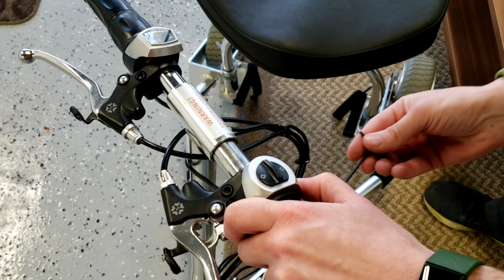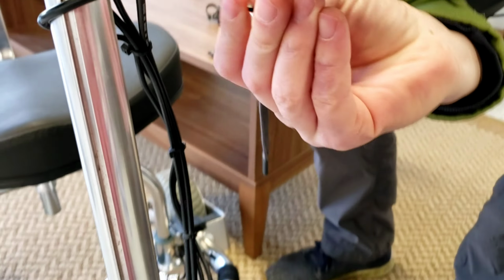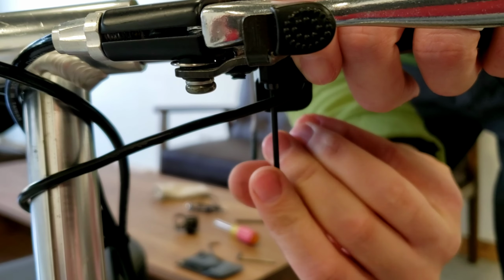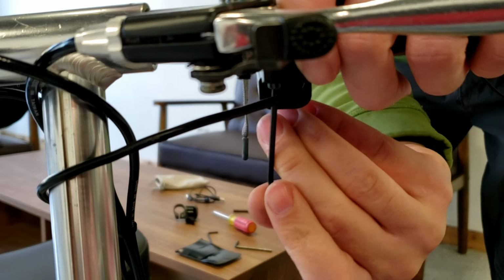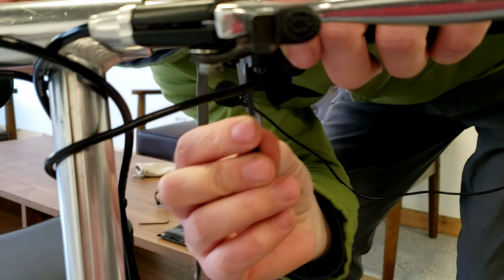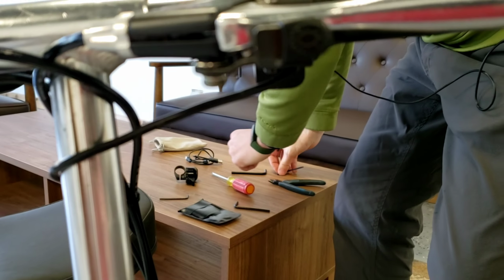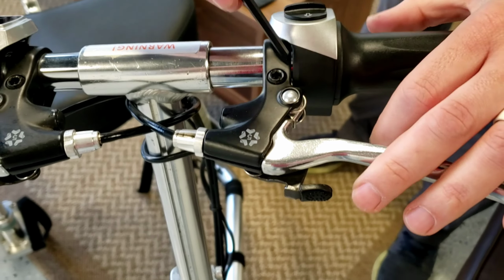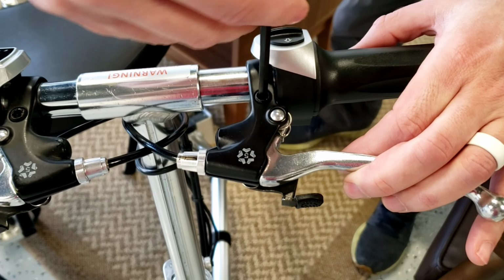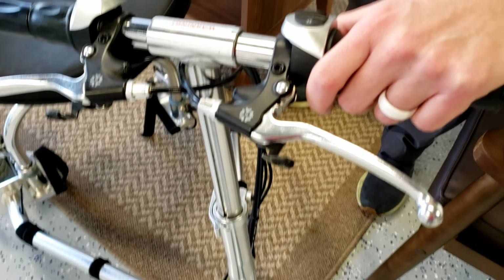I'm going to grab again my 3mm. Tighten that up. And then the 5mm is the largest one. And you're good to go. That's fixed.